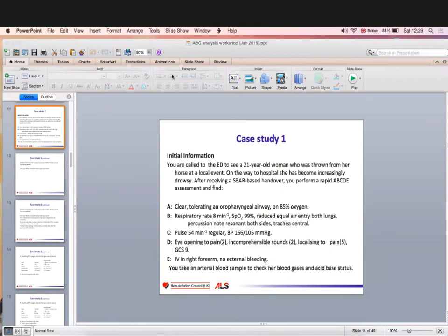Yeah, the lactate can be normal or it can be high. We can't really tell about it. Although he's maintained a saturation of 99, as you told, the oxygenation might be poor, isn't it? So the lactate can be high. We really don't know. Okay. Does it make sense?